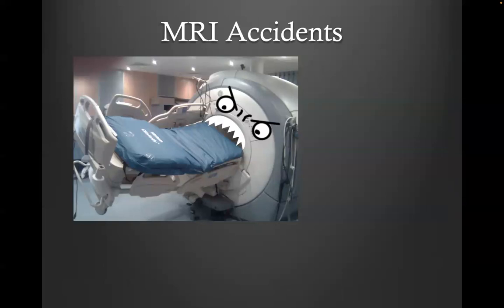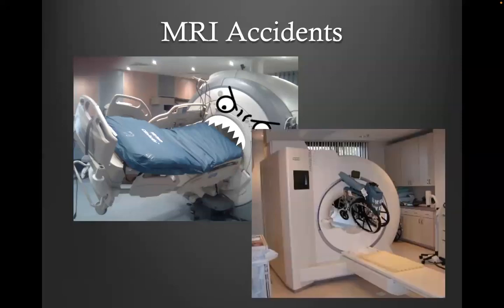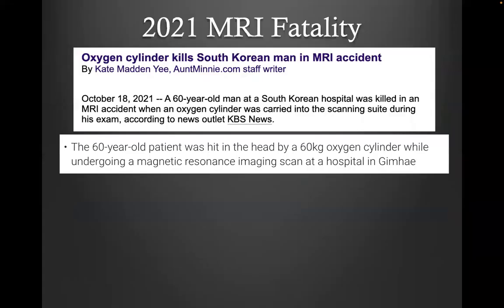If you Google MRI accidents, you are going to see all kinds of crazy images. Accidents still happen. And while you would think all the hospital staff are extremely well trained, accidents still happen. So all I can say is be vigilant when you enter the MRI room.